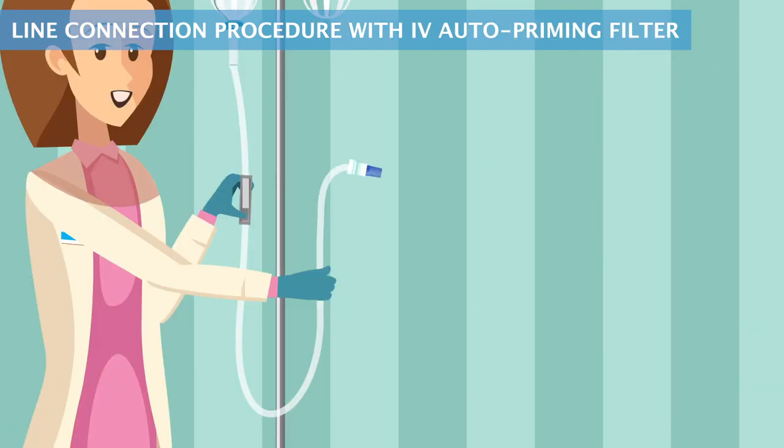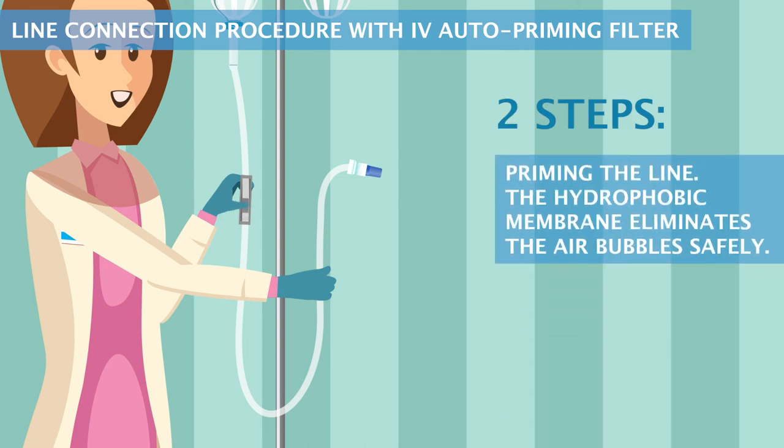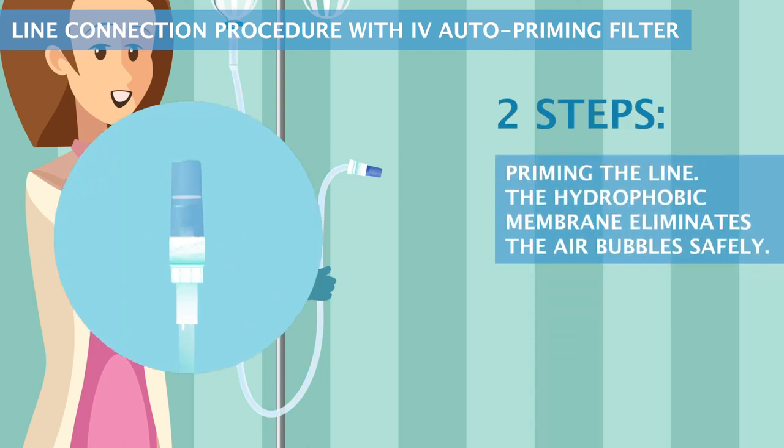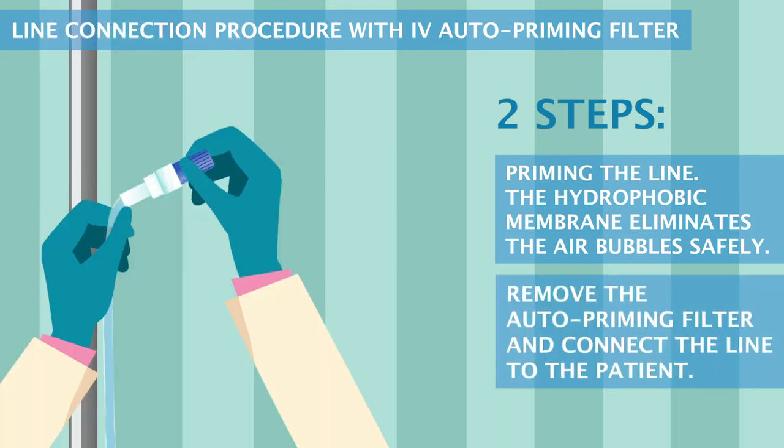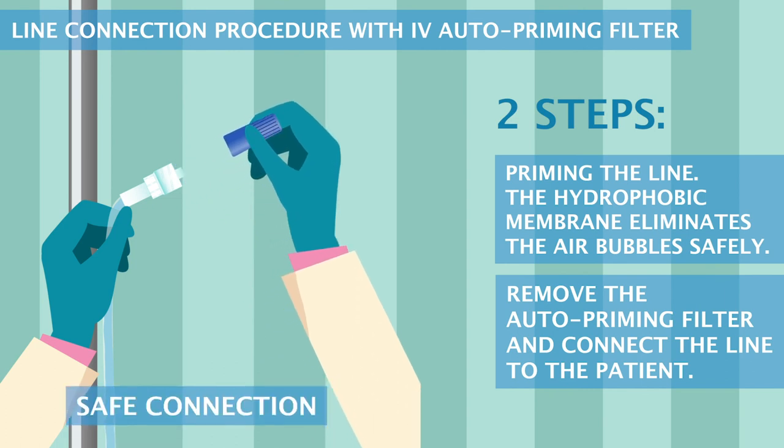Line connection procedure with IV auto-priming filter: two steps. Prime the line — the hydrophobic membrane eliminates the air bubbles safely. Then remove the auto-priming filter and connect the line to the patient.